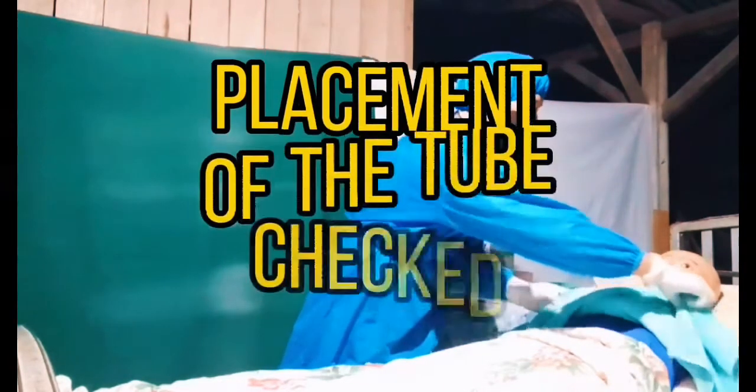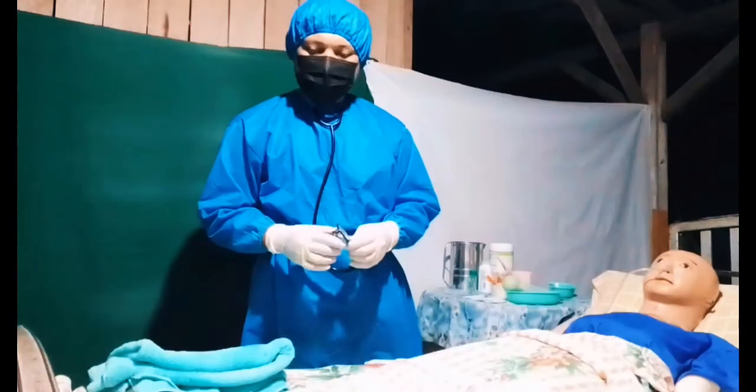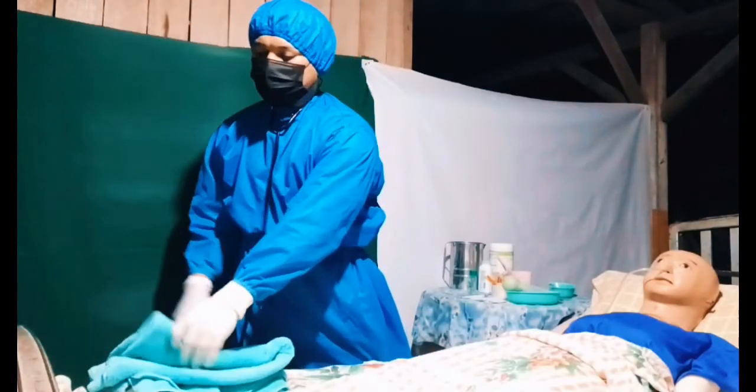Lock the tube and put it behind the pillow. Now, put the towel on the chest. Avoid messing up the bed as well as the patient.